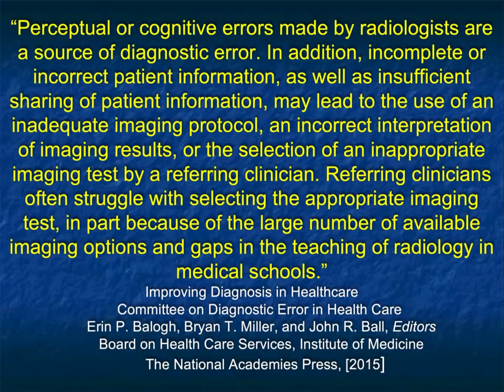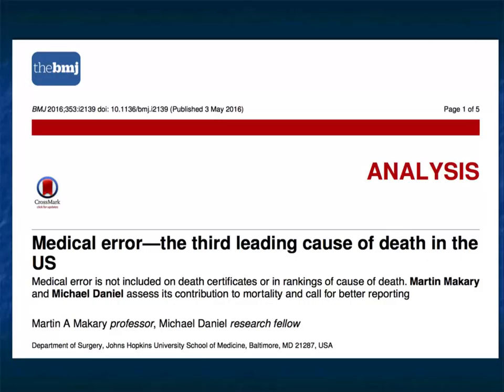Referring clinicians often struggle with choosing the right imaging exam because they just don't know what exam to order. There are rules for exams of what you should get, CT, ultrasound, MR, but we also know that availability has an impact factor, particularly in the COVID era, but also the fact, depending what institution you are, how well people do CT, or how well they do MR, or how well they do PET, or how well they do ultrasound, is indeed going to vary. So whatever the published results are, you may be better or you may be worse.